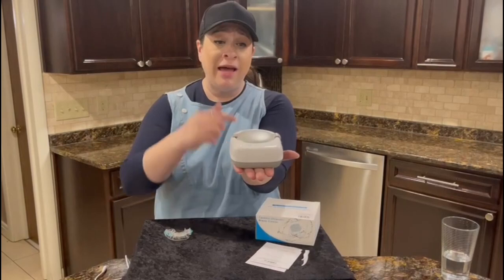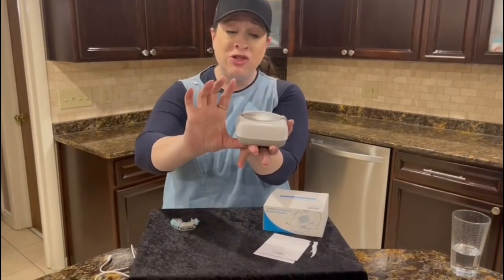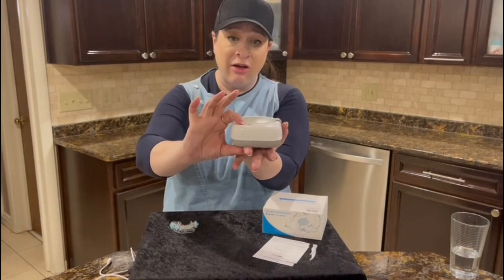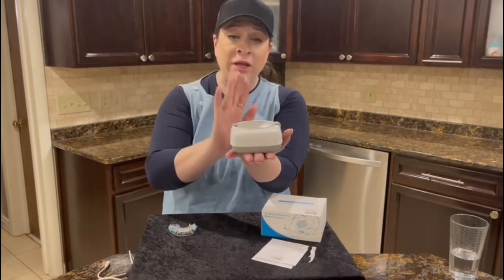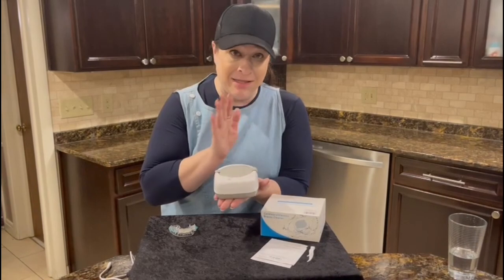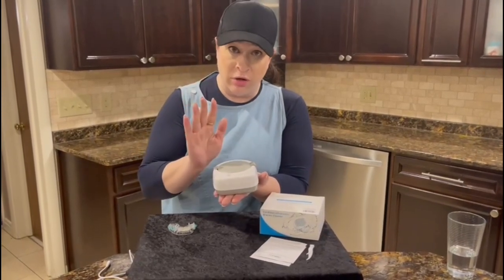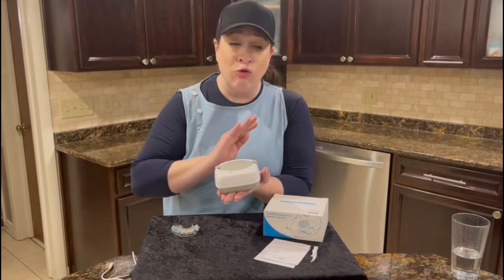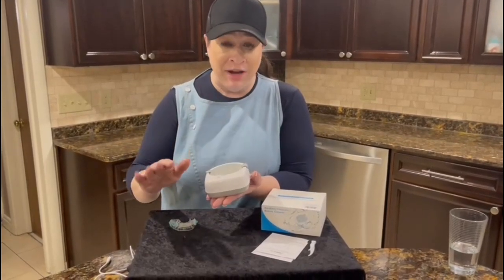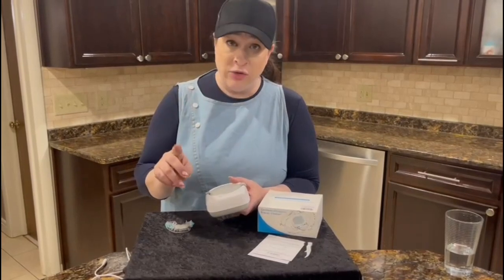First of all, look at the size — five inches by 4.2 inches and just 1.9 inches thick. So it really is compact. I have not seen on Amazon any other cleaner like this that's cordless. You can use it anywhere, even if you don't have an outlet. One charge can last up to eight uses.